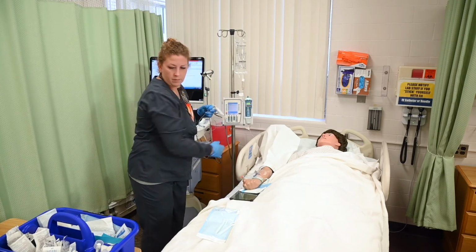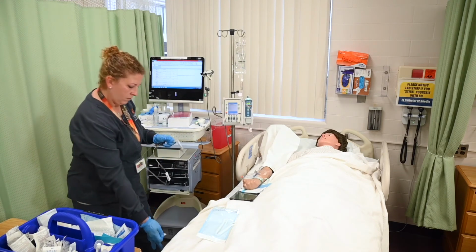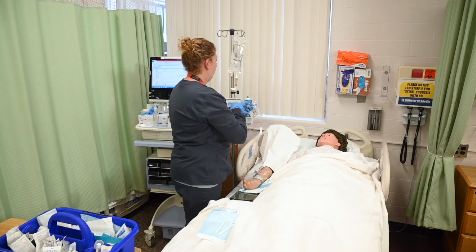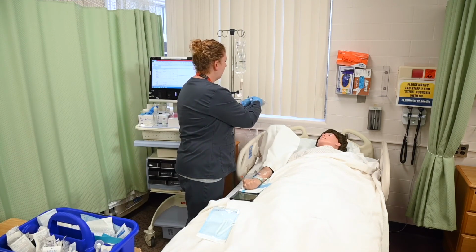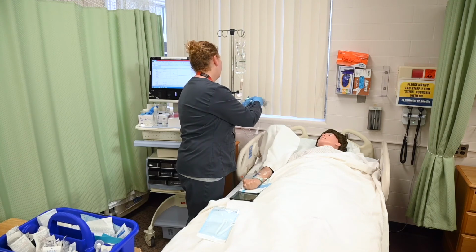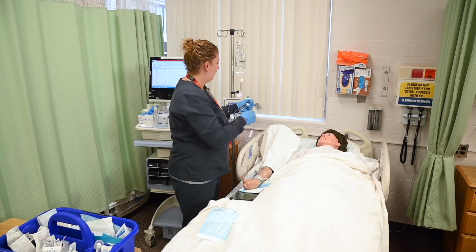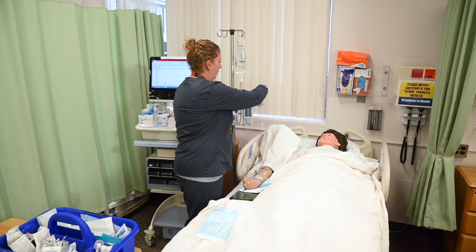Cleanse the medication port closest to the primary IV fluid and allow to dry, or remove the swab cap. Since there's no swab cap on this port, I'm going to cleanse it for 15 seconds with an alcohol prep pad and allow it to fully dry. Attach the IV Piggyback tubing without contamination.